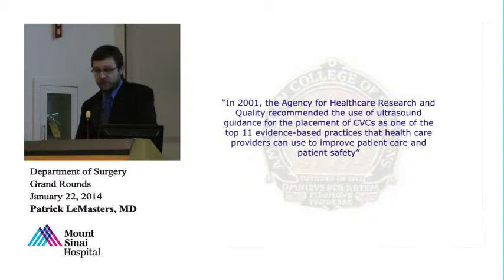Also, in 2001, the Agency for Healthcare Research and Quality recommended the use of ultrasound guidance for the placement of central venous catheters as one of the top 11 evidence-based practices that healthcare providers can use to improve patient care and patient safety. This went along with such things as washing your hands and performing a surgical checklist.